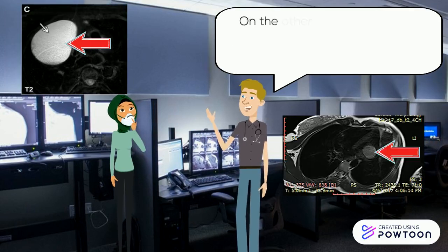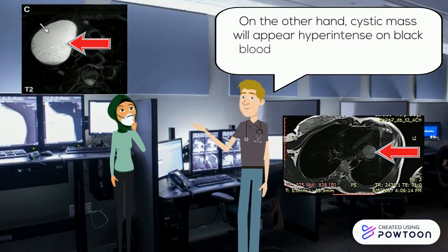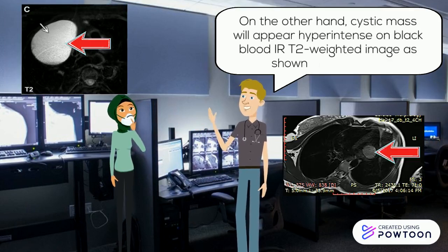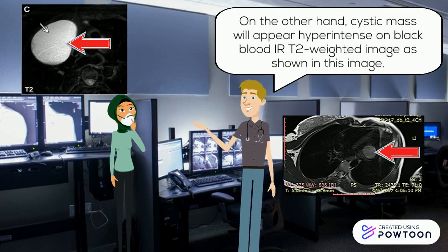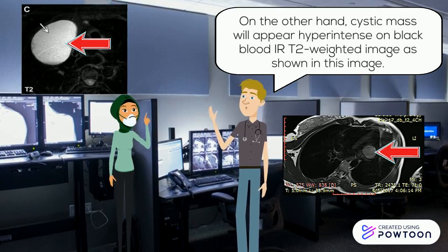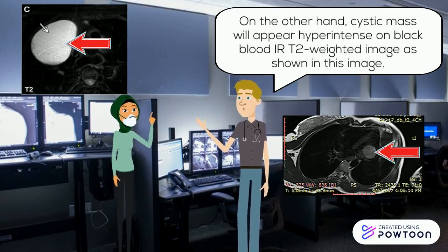On the other hand, a cystic mass will appear hyper-intense on black blood inversion recovery T2-weighted image, as shown in this image.